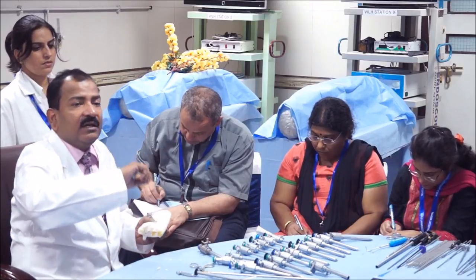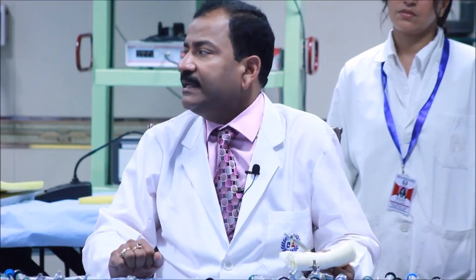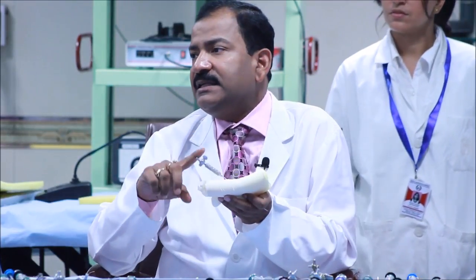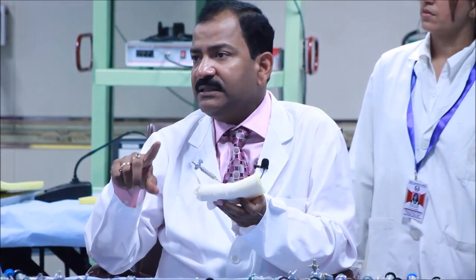Now, these are the tests. After that, you will start the pneumoperitoneum. And once the pneumoperitoneum is started, there is one more test which is called the quadromanometric test. Quadro means four, manometric means pressure test. So: irrigation test, suction test, hanging drop test. The hanging drop test also can be replaced by the plunger test, and then the quadromanometric indicator. I can demonstrate the quadromanometric indicator during the insufflator presentation, so I will discuss that separately.